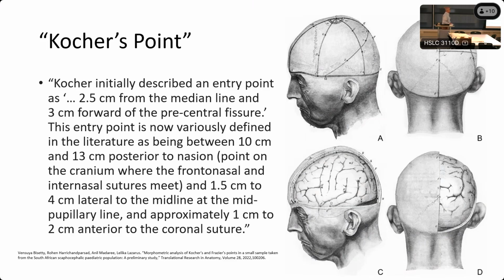But what he did was he had this little pseudo stereotactic device that would mount as a band around the head and then define points. And he said that this point and this point were safe access points to the ventricle. Because we don't use this device anymore, we're all interpolating what he probably meant with this.